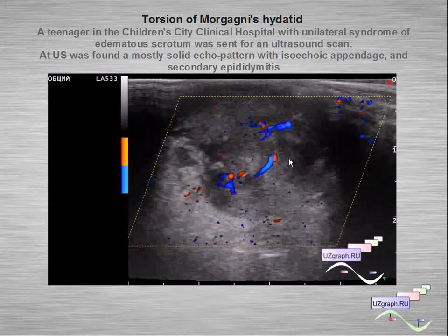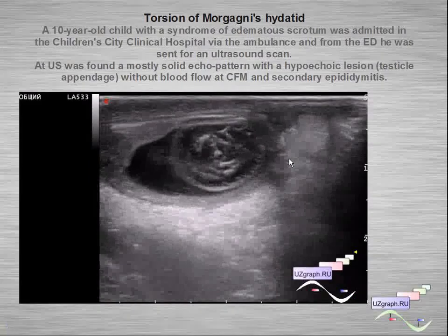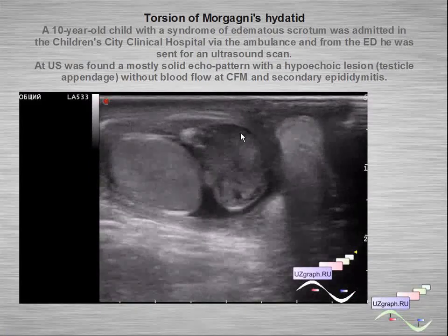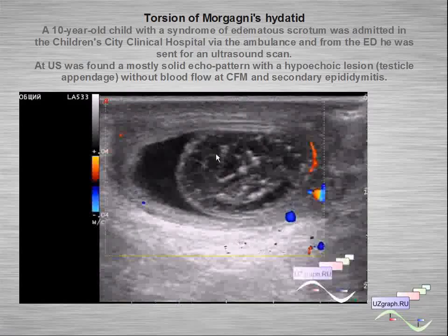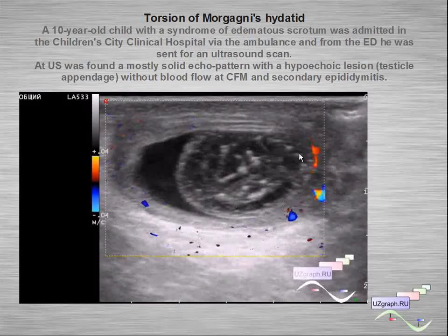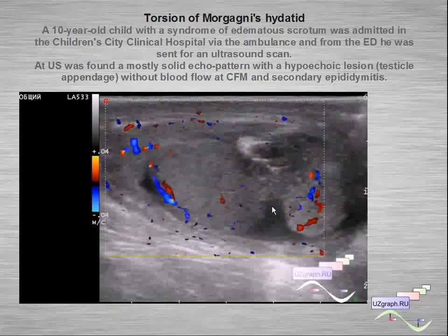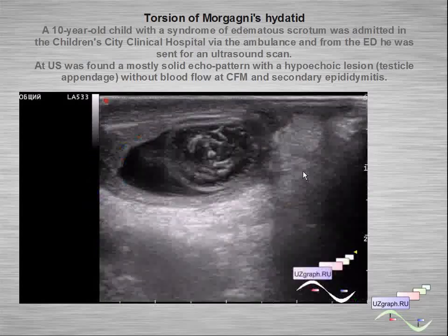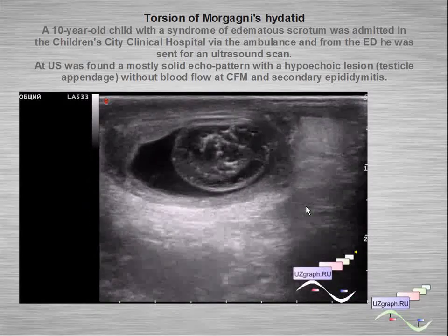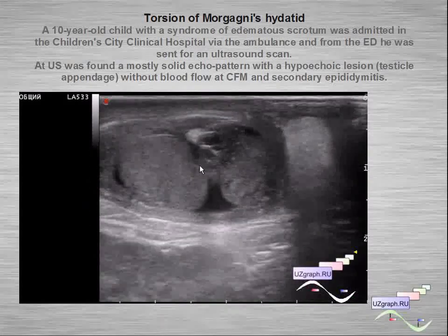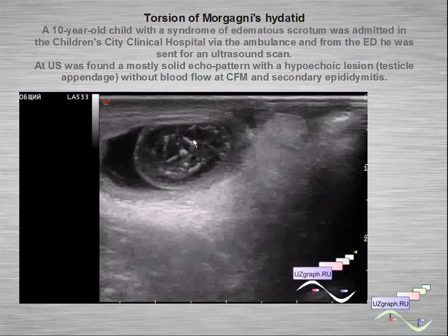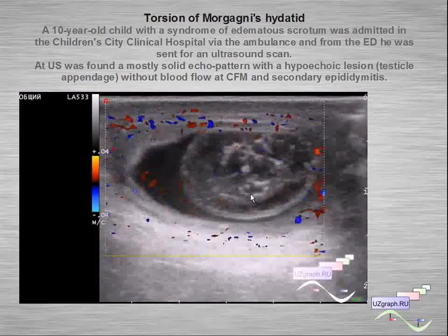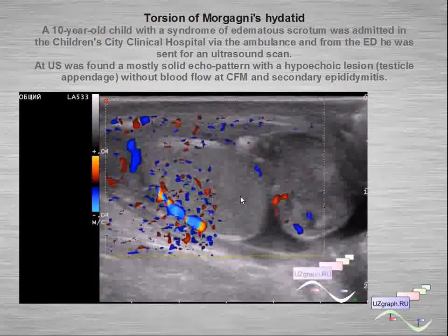Another echo pattern showing a large lesion near the testicle and epididymis, which is torsion of Morgani hydatid, without blood flow at color flow mode.